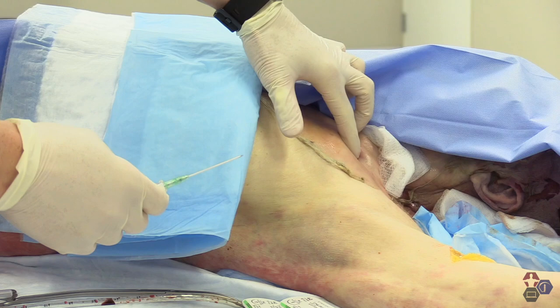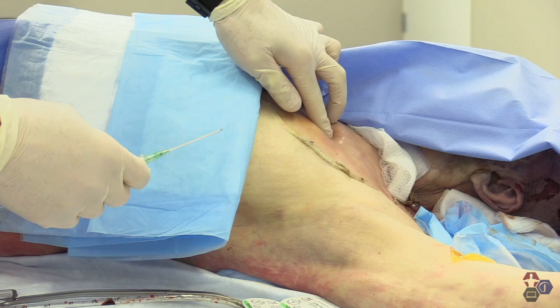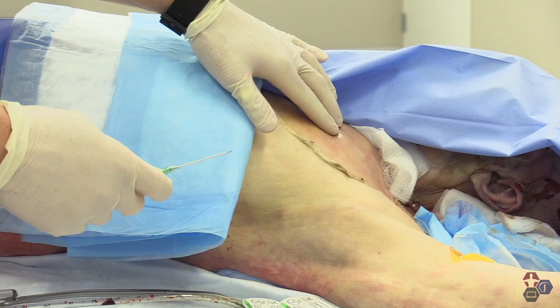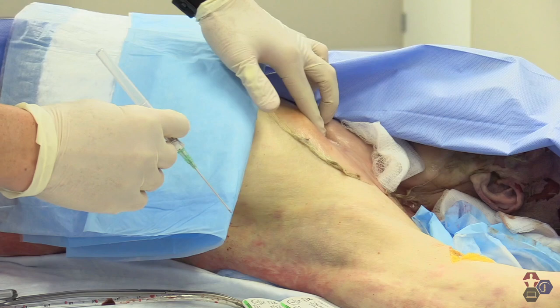So the first thing we're going to do is take a look at the chest wall itself. As you can tell anatomically, you have the mid-clavicular line. You want to come down here to the second intercostal space, right down the mid-clavicular line. Obviously, don't go too medial because you want to avoid hitting the sternum and some of the mammary arteries, and don't come too lateral to avoid hitting the other structures of the body.